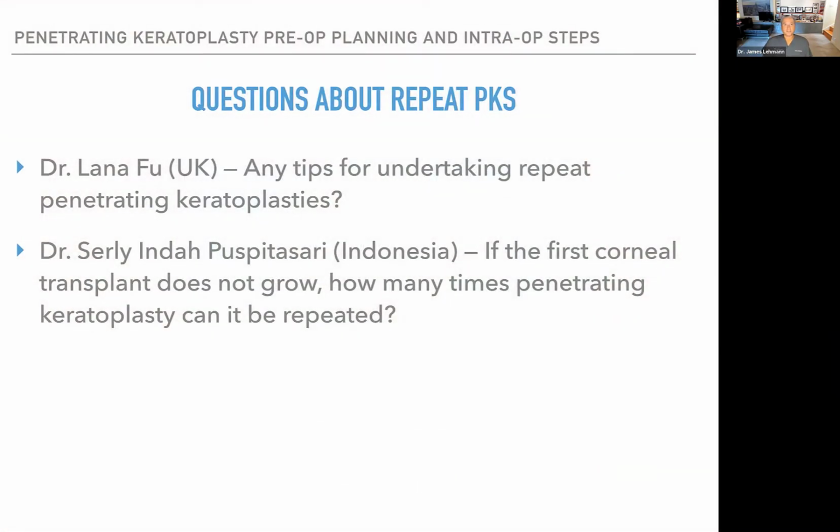Okay, so these were some questions about repeat PKs. Dr. Lana Fu from the UK asked, any tips for undertaking repeat penetrating keratoplasty? I like to look for the centration of the previous PK, and most of the time I will re-trephinate.